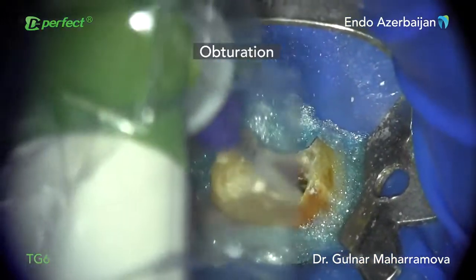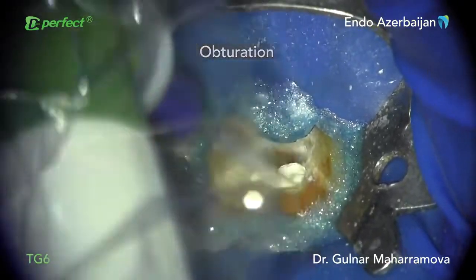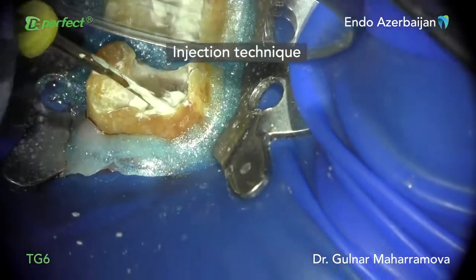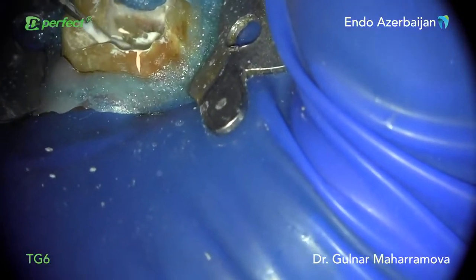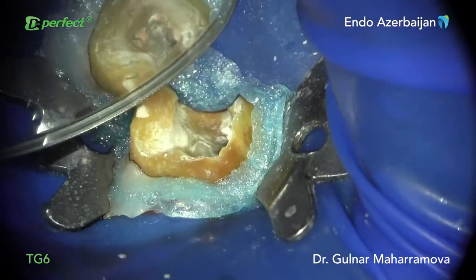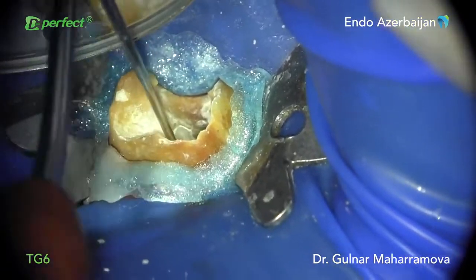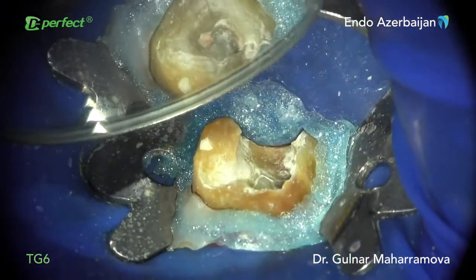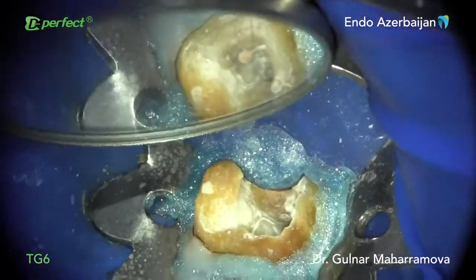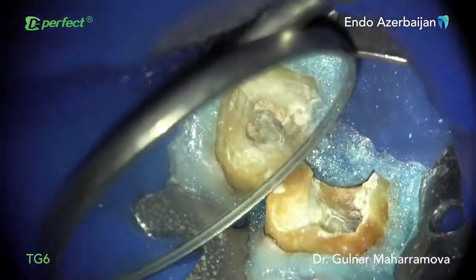After irrigation, the canal space was dried and the sealer was placed. According to the irregularities and complexity of the root canal space in this specific case, I used injection of warm guttapercha to get a better sealing and obturation. Finally, when the excess cavity is cleaned from excess guttapercha and sealer, the patient can proceed with the restoration.